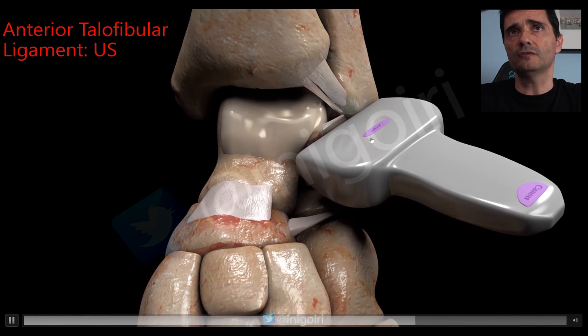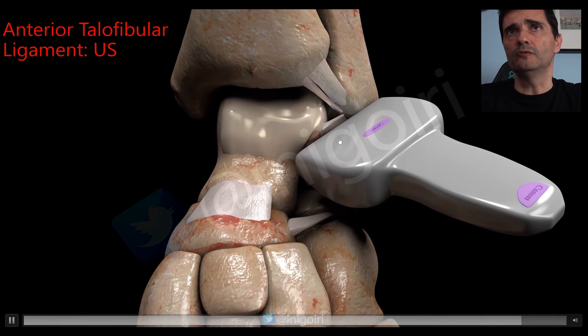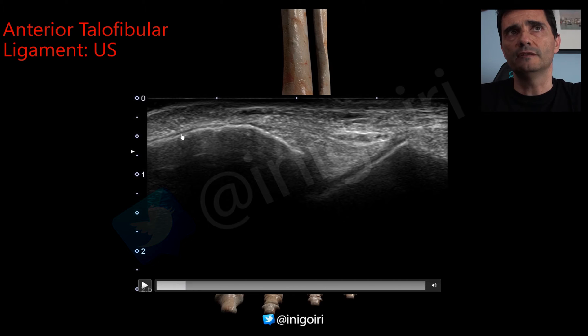Move the probe downwards and upwards. You need to see this image with the fibula here and the talus — the black image is the cartilage — and between the fibula and the talus you can see this hyperechoic structure.